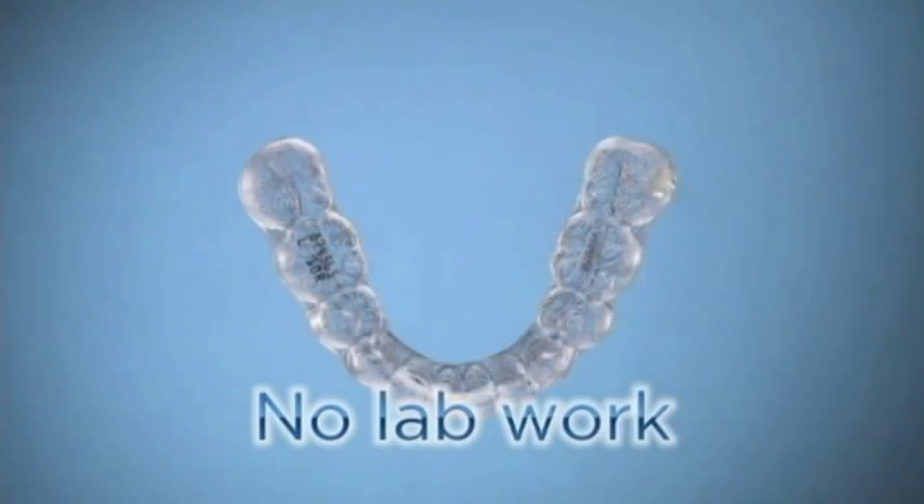Our patients have been very receptive to Vivera. We recommend that all patients finishing with Invisalign receive Vivera, as well as patients who are just coming in looking for a retainer solution — that's the only product we really recommend to them, and they all seem to love it. One of the best things about working with Vivera retainers is that we can take an impression and send it out without having to pour up models or do any lab work.